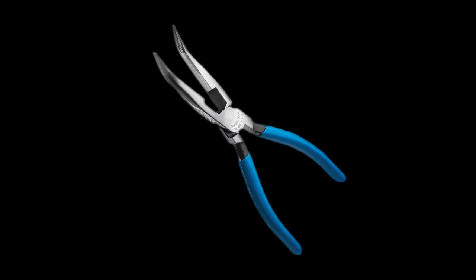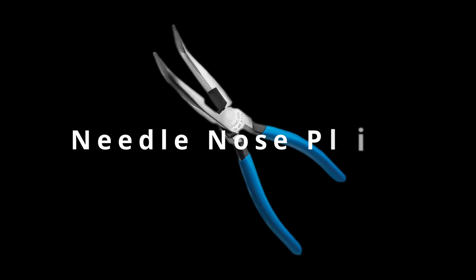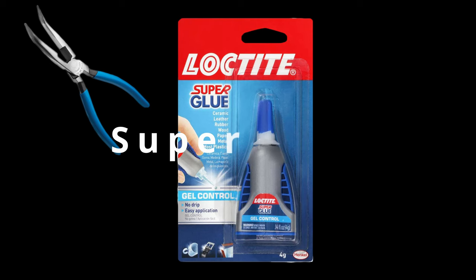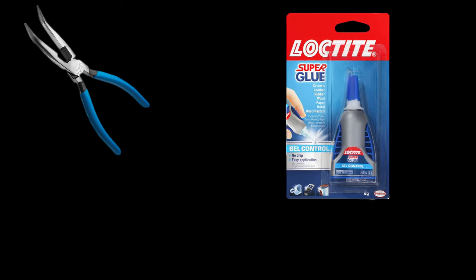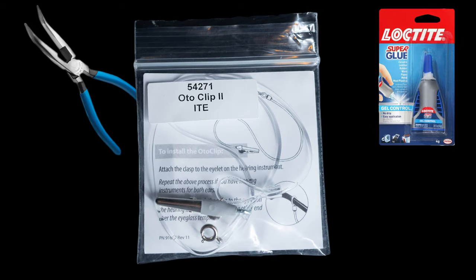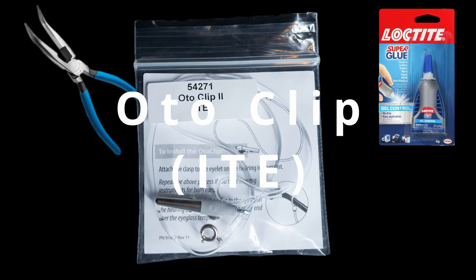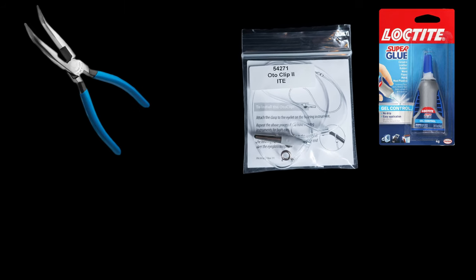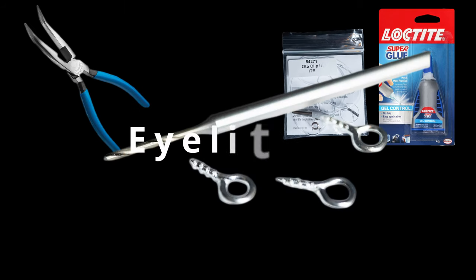Now you can get everything from Amazon except for the eyelet kit. And again, I'll have links to everything. So get yourself a pair of needle nose pliers. I really like the ones that have a bend to them. You're gonna want some super glue, and then the actual Otoclip itself. And then lastly, the eyelet kit. This is gonna include four different eyelets or eye hooks, and the tiny little drill bit that you're gonna need.